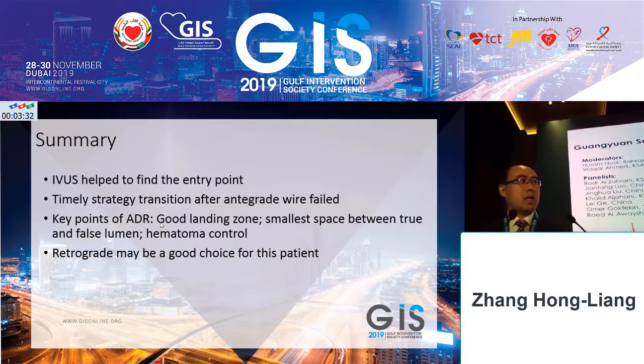For this patient, the collateral from the septal branch is very good. Retrograde approach may be a good choice for this patient.